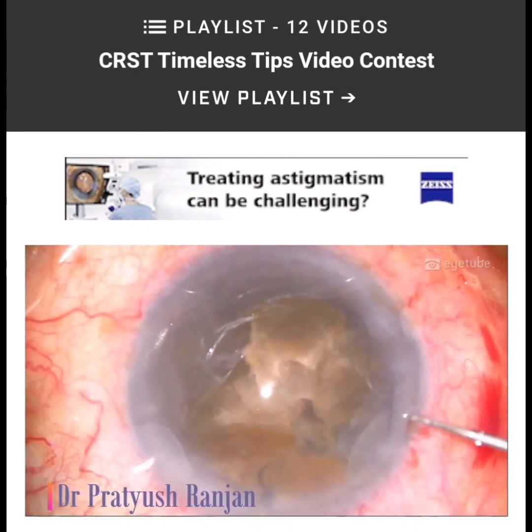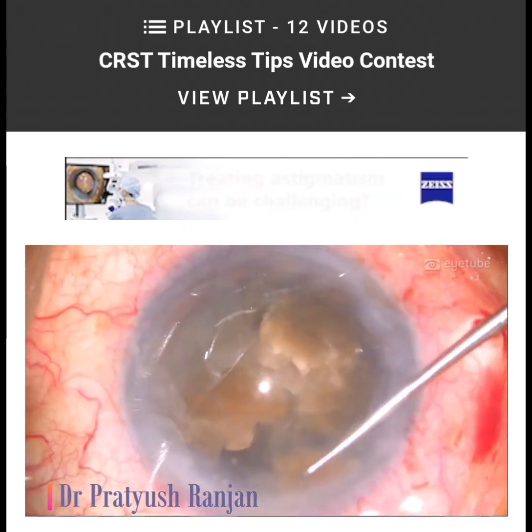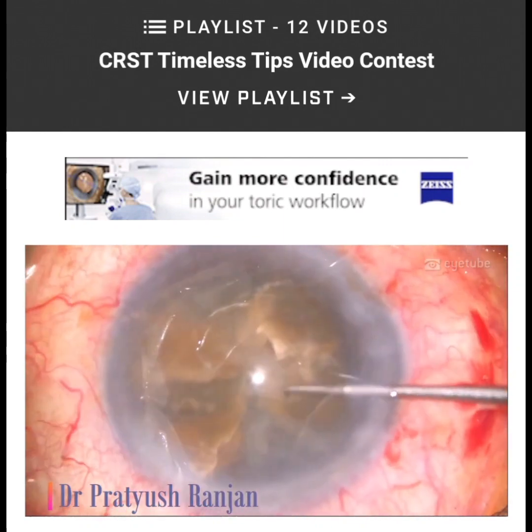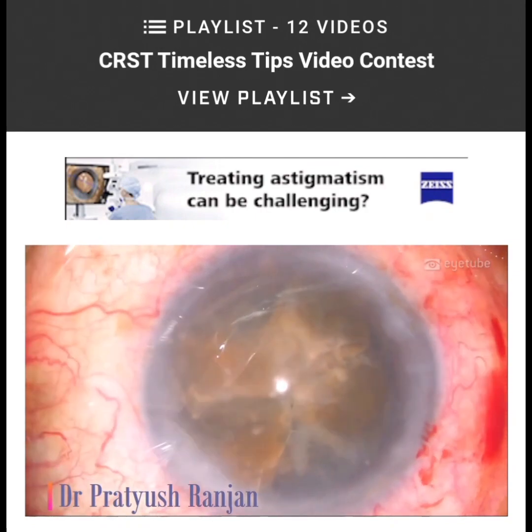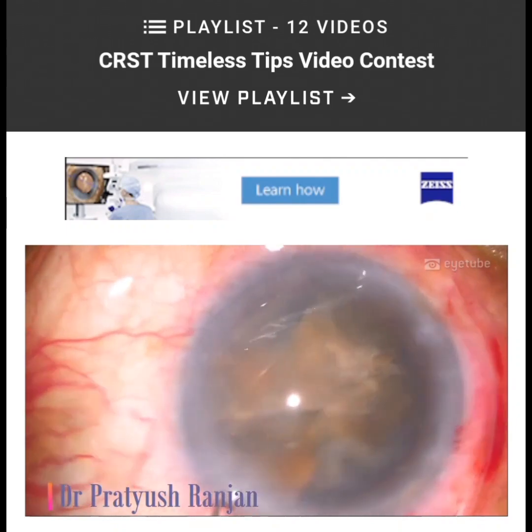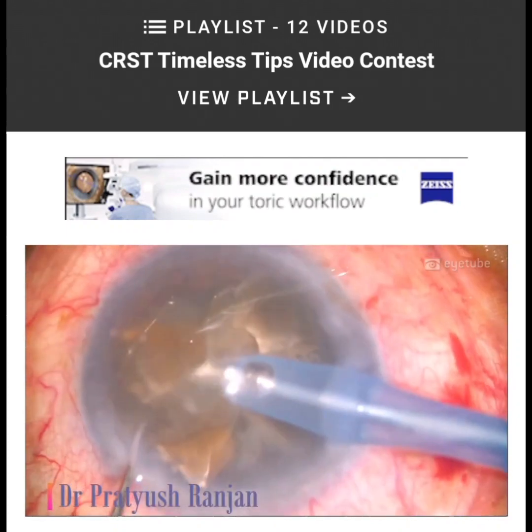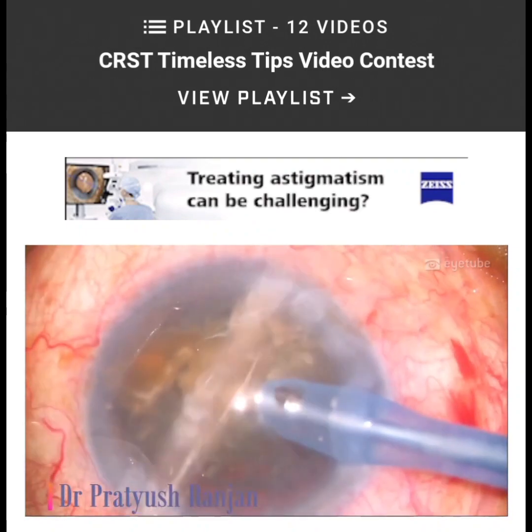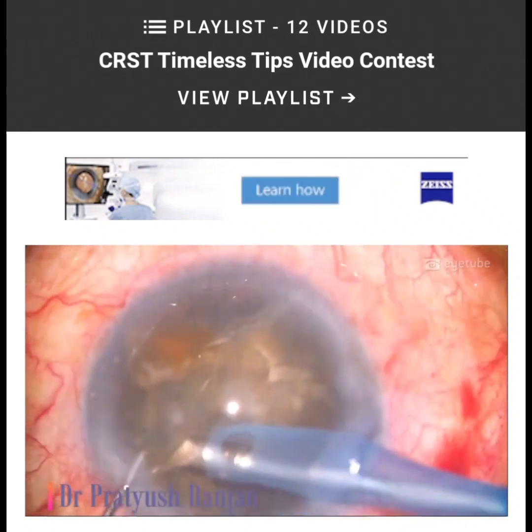This one is also a brown leathery cataract, difficult to manage, but very well managed by your cartwheel chop. I've been using this technique for the last 6-7 years, and that was the time when I started teaching young fellows how to do phaco. So I understood their problem, and that came as a technique to help them overcome their fears and learn this technique.